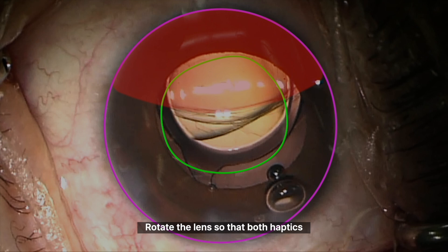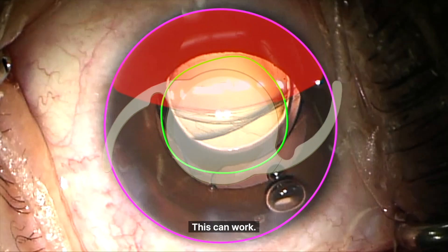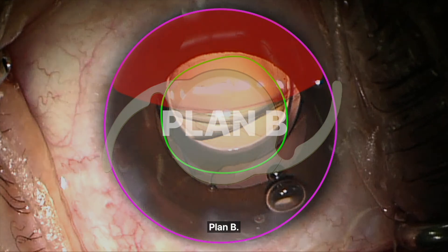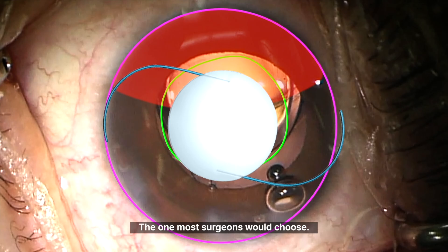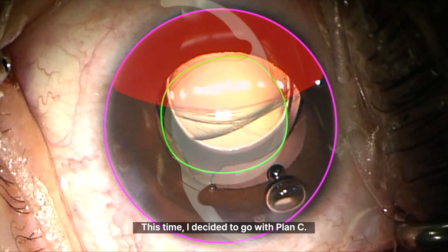Plan A: rotate the lens so that both haptics rest on the remaining capsule support. This can work — it's safe and effective — but only when the area of rupture is relatively small. In this case I wasn't so sure; it felt risky. The vitreous might start to prolapse, causing the lens to tilt, and in some cases the entire IOL can drop back into the vitreous cavity. Plan B: take out the one-piece IOL and place a three-piece lens in the sulcus. This is the most standard option. It's reliable and safe. A one-piece lens should never be placed in the sulcus — the thick haptics can rub against the iris and cause UGH syndrome, sometimes years after surgery. That's why in the sulcus it should always be a three-piece lens.